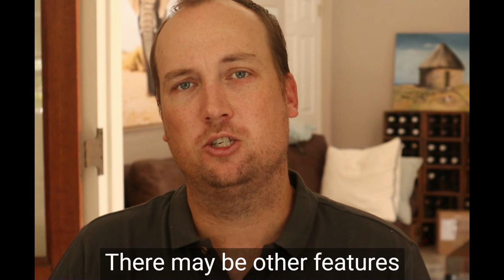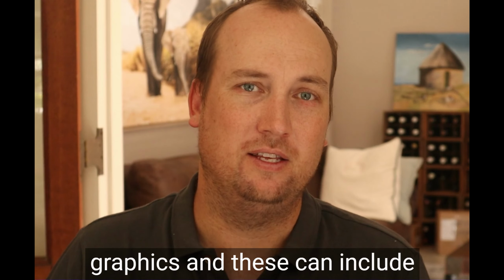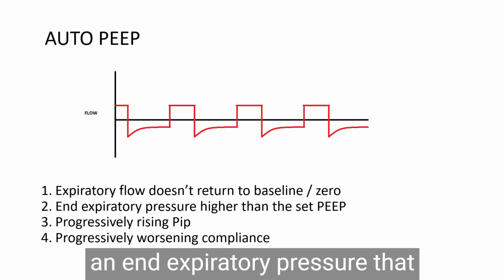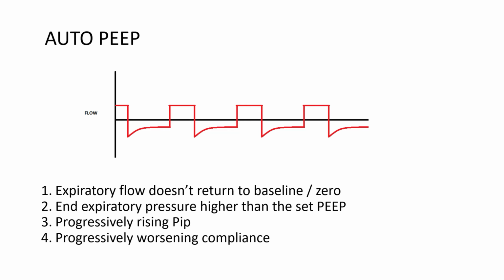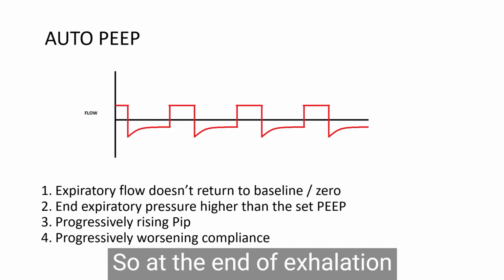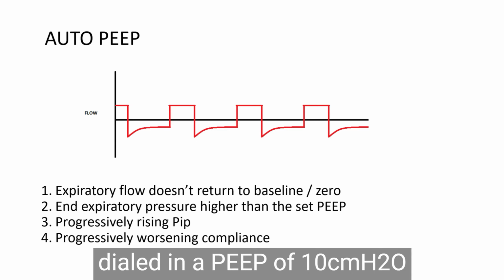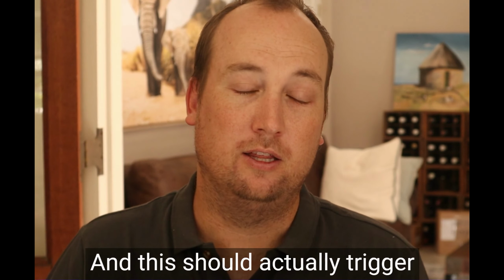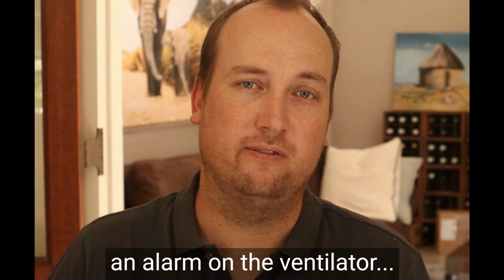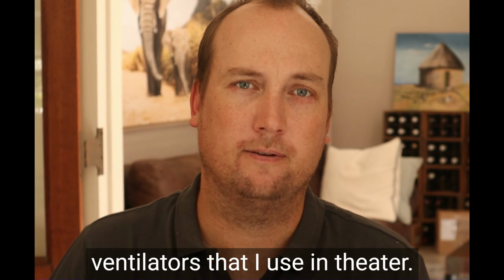There may be other features of auto-PEEP on our ventilator graphics, and these can include an end expiratory pressure that is higher than the set PEEP. So at the end of exhalation, perhaps our airway pressure is 15 centimeters of water, and we've only dialed in a PEEP of 10 centimeters of water. That is a sign of air trapping. And this should actually trigger an alarm on the ventilator. I know it certainly does on the ventilators that I use in theatre.